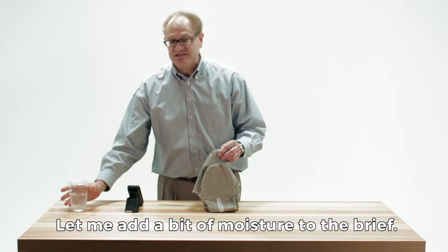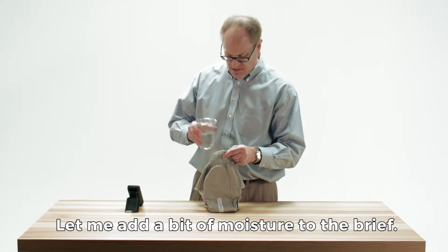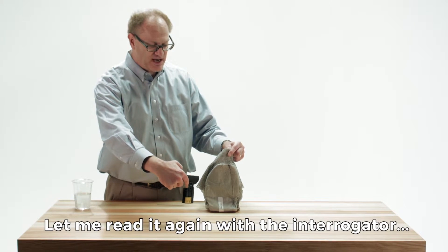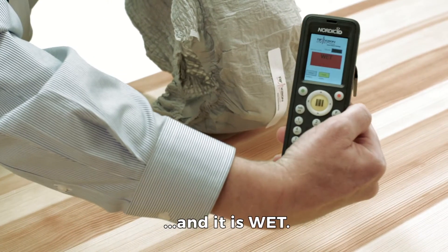Let me add just a little bit of moisture here to the brief. And let me read it again with the interrogator. And it is wet.